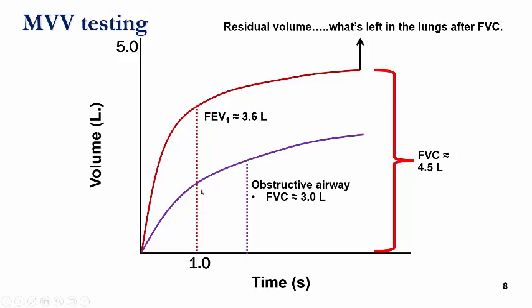Now, this value does vary a little bit, even within people that are free of any sort of pulmonary condition. Now, the lower purple tracing is a typical response we see in a person afflicted with an obstructed airway. And so the FEV1 we can see here is shifted, or the 80% point is shifted to the right.